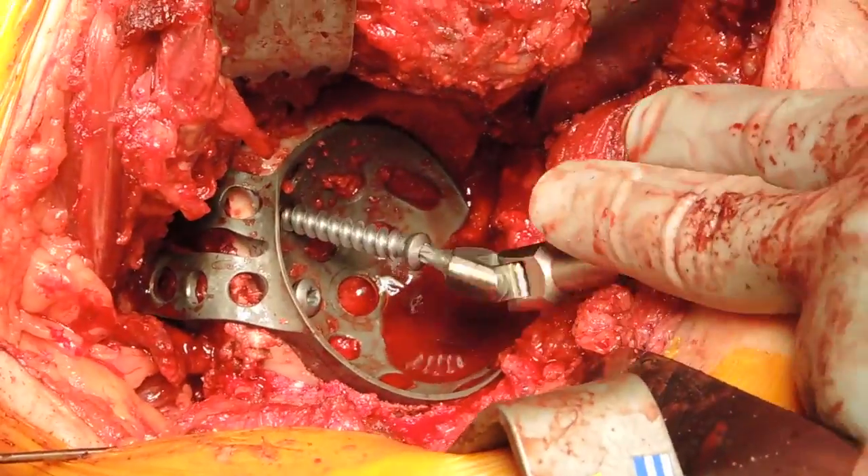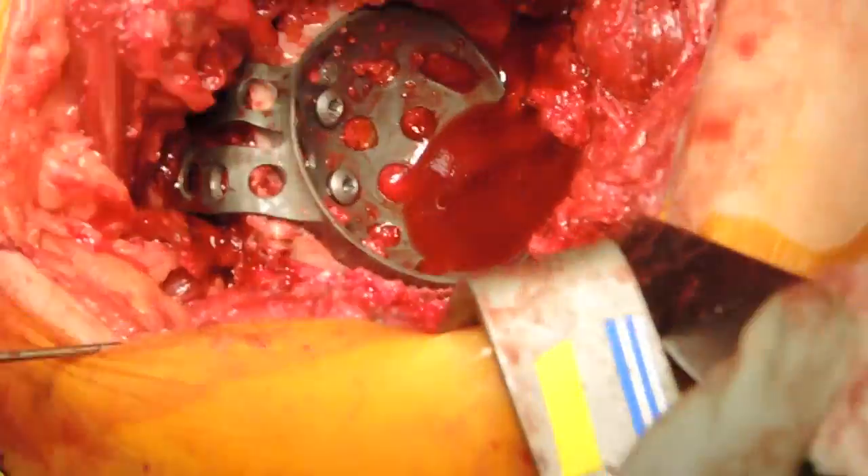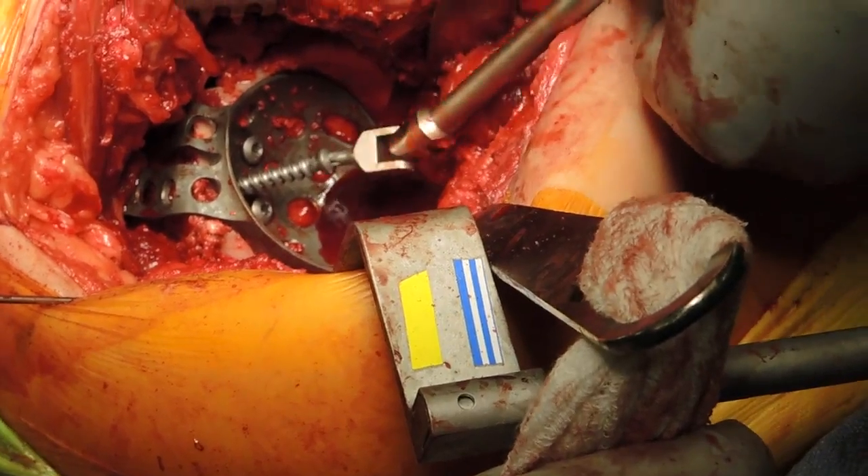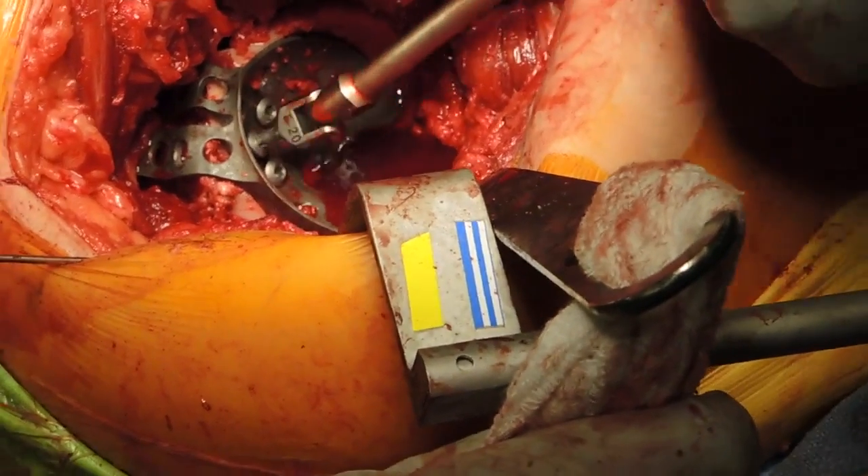We make every attempt possible to assure that the screws go through the cage, into the allograft, and into host bone.